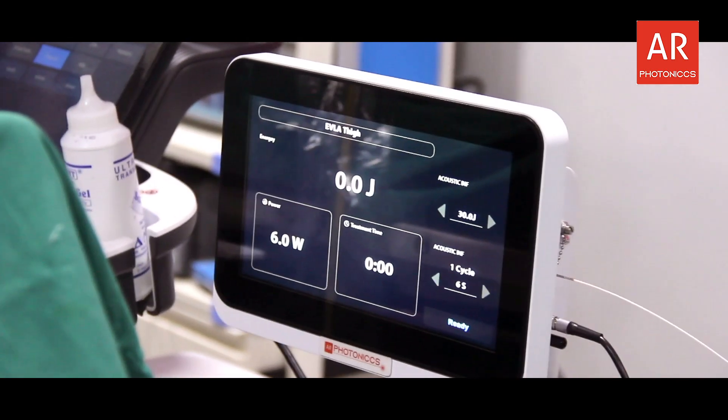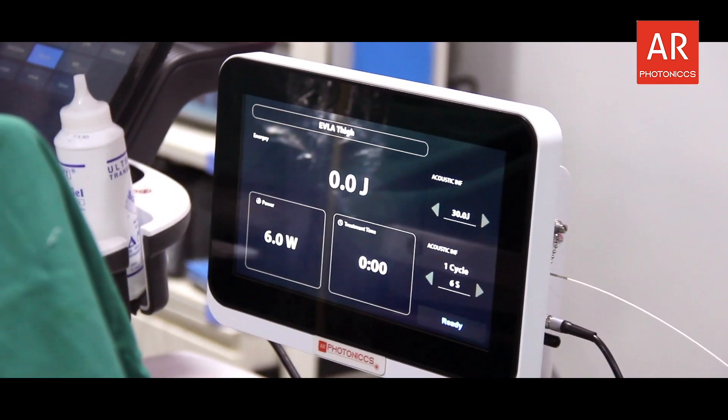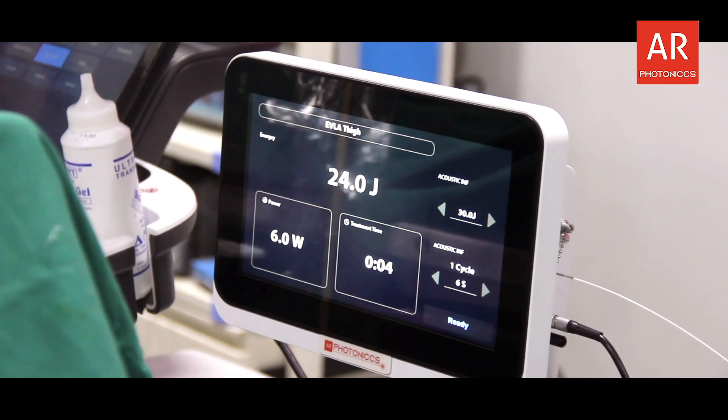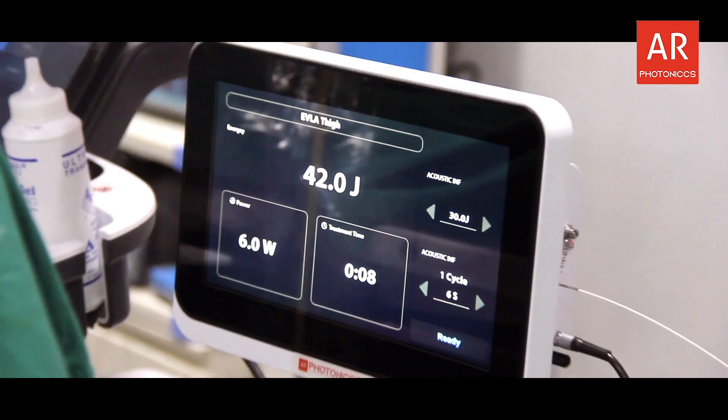Now while you are ablating, the first marker you come across is the sheath marker. What are you supposed to do? You start ablating. Once we see the sheath, we railroad the sheath over the fibre — you have to railroad the sheath over it.